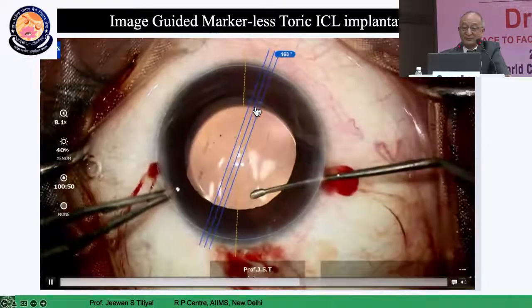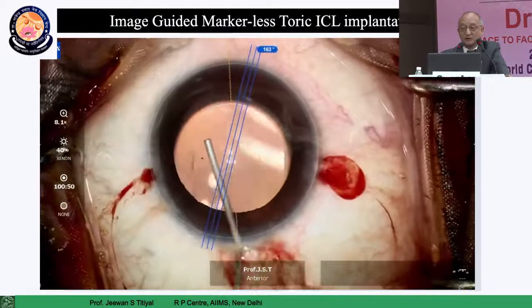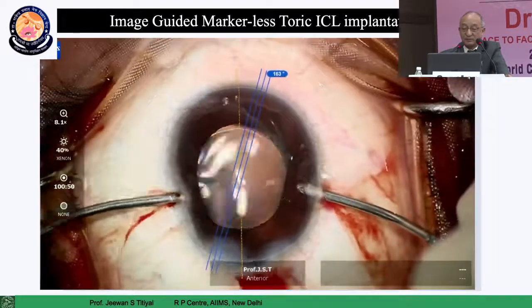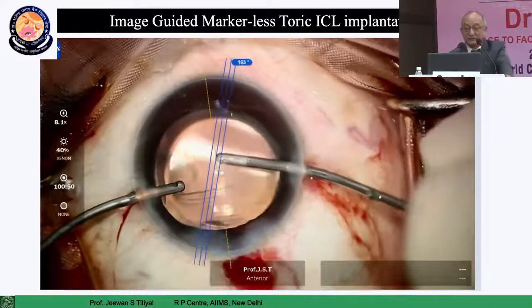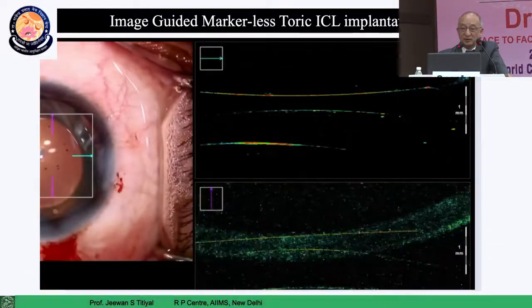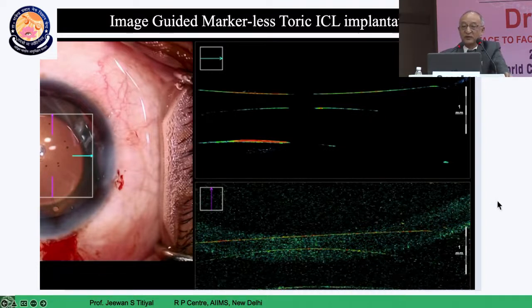Rotate the lens to the main axis of implantation before you take out the viscoelastic — this is very important because it is very difficult to rotate afterwards, and you might damage the anterior lens capsule. With this maneuver, you can remove 90-99% of the viscoelastic with simple anterior chamber manipulation. Remaining viscoelastic underneath the ICL can be removed through the central port, and you can go to the periphery as well — the two holes allow further aspiration. Complete viscoelastic removal is possible using sodium hyaluronate, whereas methylcellulose may not give you that access.